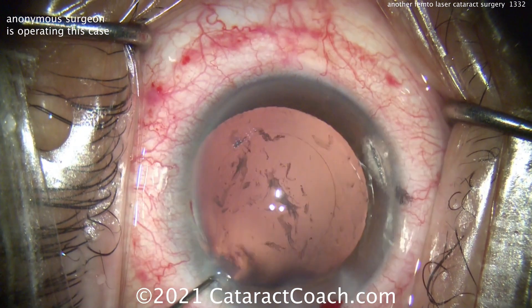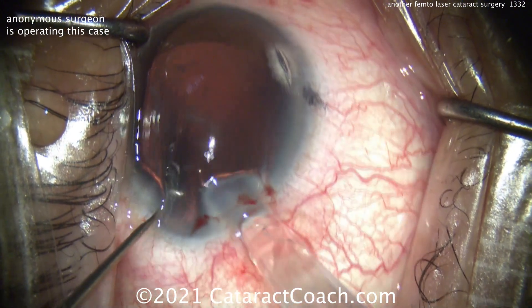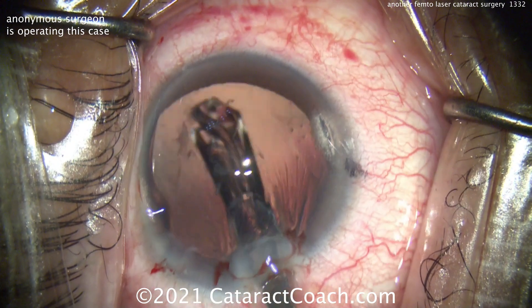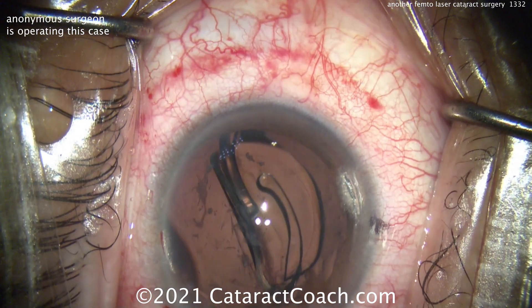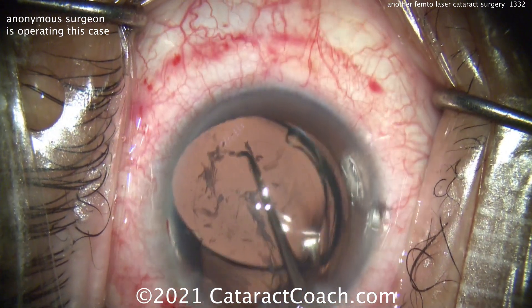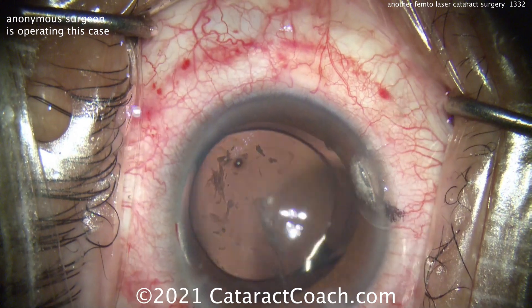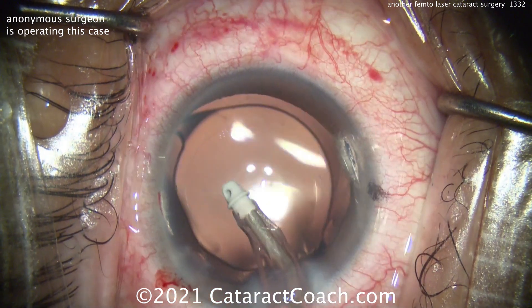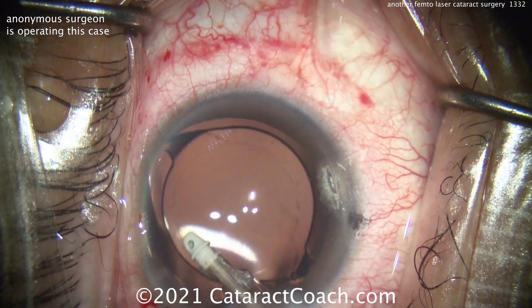Here comes the lens delivery. You see the two corneal incisions there — the astigmatic treatments? Those you can open up now or you can wait and titrate it later. Those incisions have been made with the laser; just making them obviously causes some flattening. You may want to watch the patient in the post-op period, see them back a few weeks after surgery, and if you need a little bit more flattening, you can use a blunt instrument like a Sinski hook at the slit lamp to open up those incisions a little bit more. And you can see there's our single-piece acrylic lens in the back — looks like an AcrySof IQ lens based on that central optic. That looks very nicely positioned.